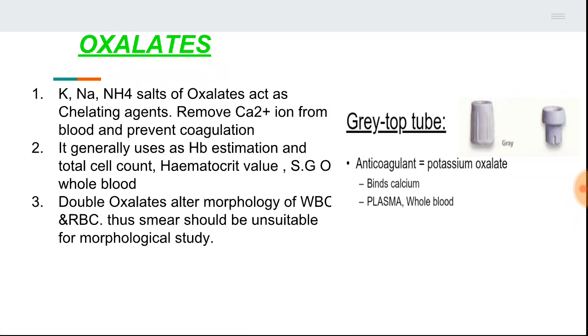Here the grey top vial is used, in which the anticoagulant potassium oxalate binds with calcium and prevents coagulation.